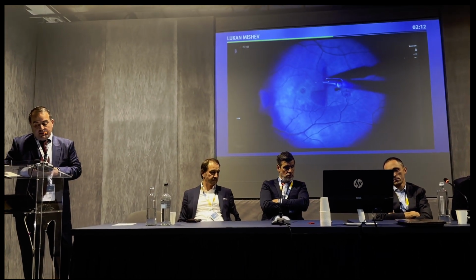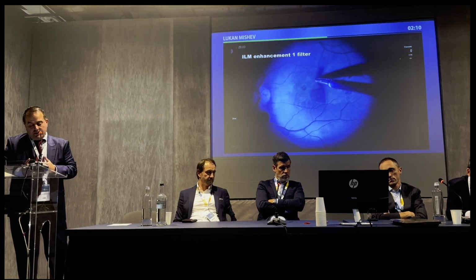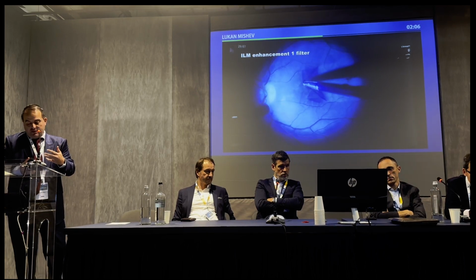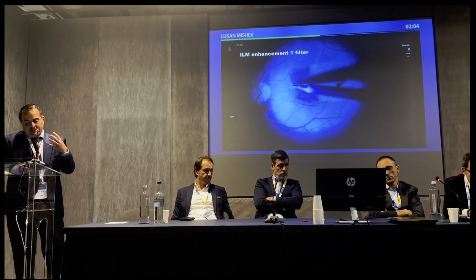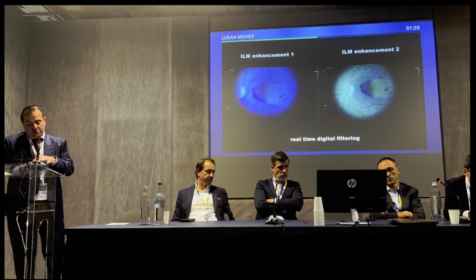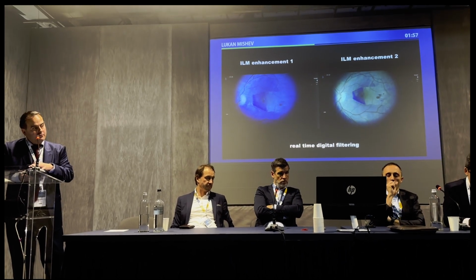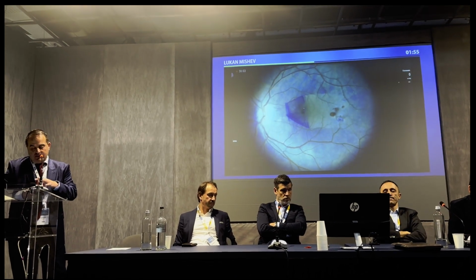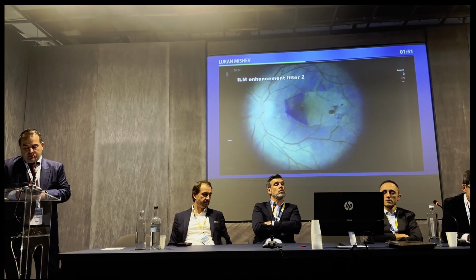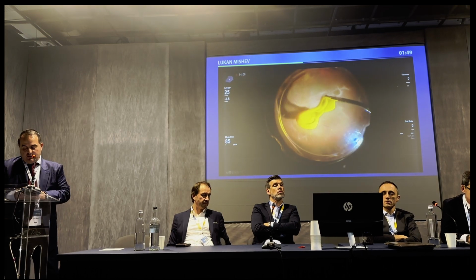Another example, and since we have funduses with different reflectivity, we might need a set of digital filters, because you see two types of filters on the same fundus can produce a different enhancing effect. So it is important to know our system.